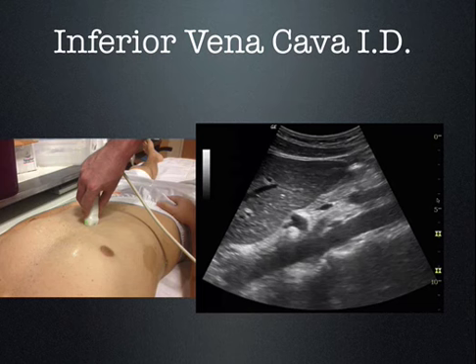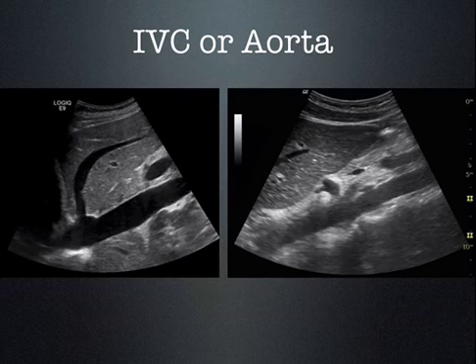Okay? Now sometimes you're going to misidentify the aorta as the inferior vena cava. There are two key structures on the aorta that will help differentiate that, and that is the celiac trunk and the superior mesenteric artery. Also, if you look very carefully, you see that the aorta is diving behind the liver, not through the liver like the vena cava does. Here is the vena cava again.